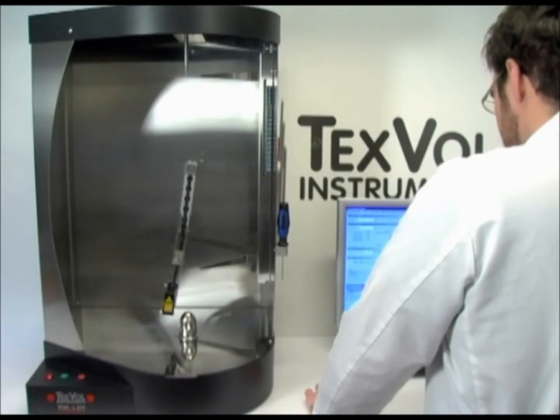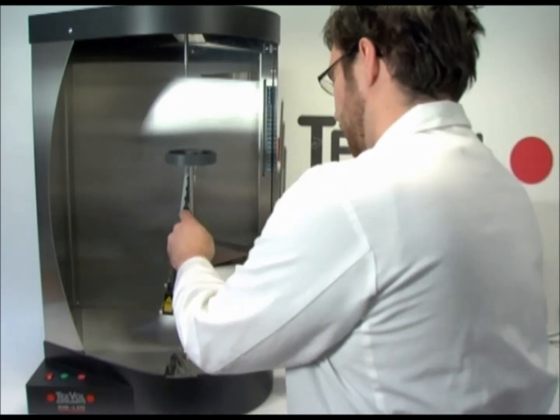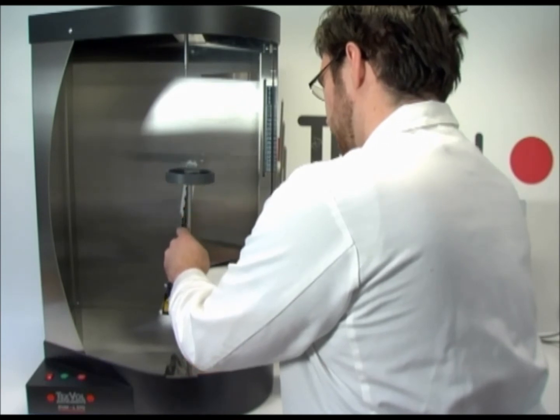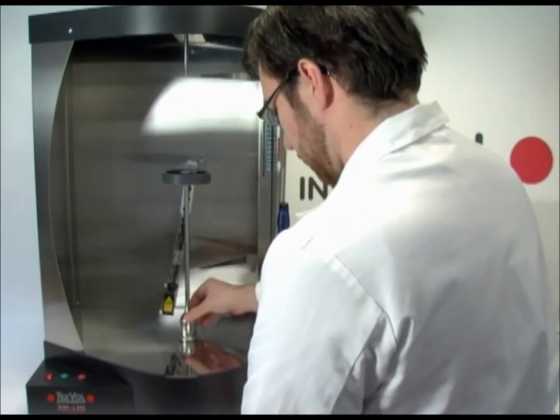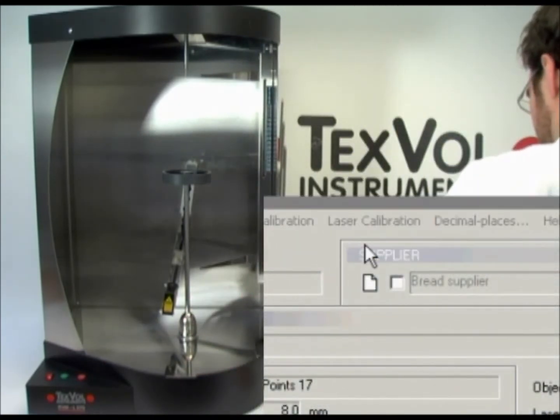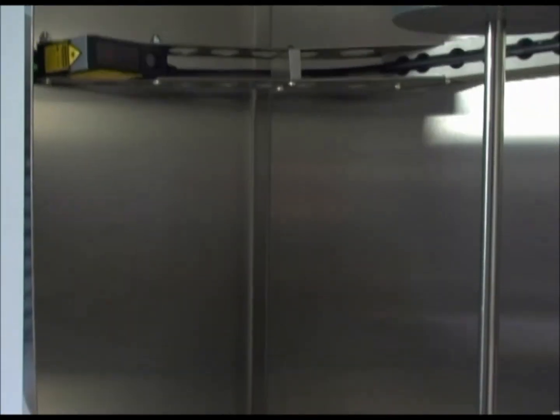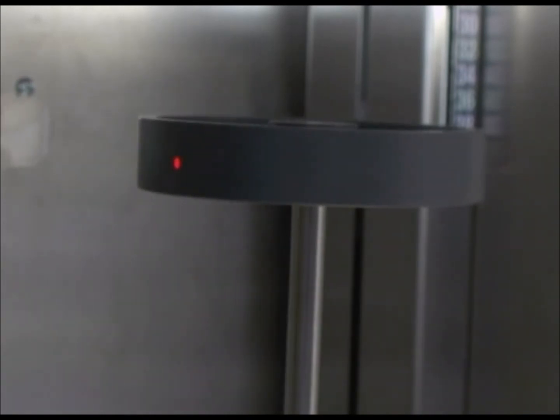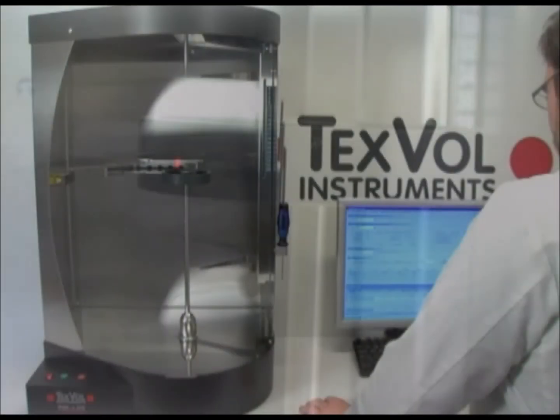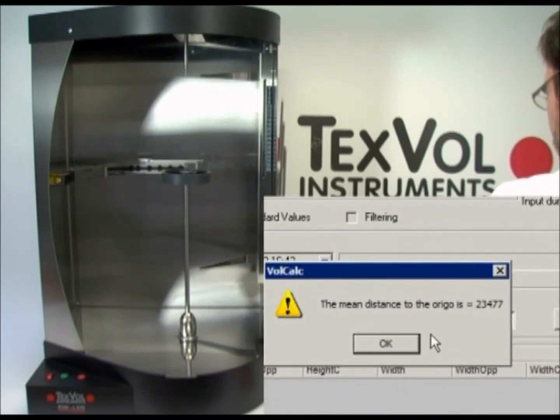Initially, the instrument needs to be calibrated using the calibration cylinder. Make a routine to perform this regularly — that could be once a day. Attach the calibration support shaft with a plastic cylinder to the instrument. Click on Laser Calibration on the toolbar. Click OK to start the calibration.